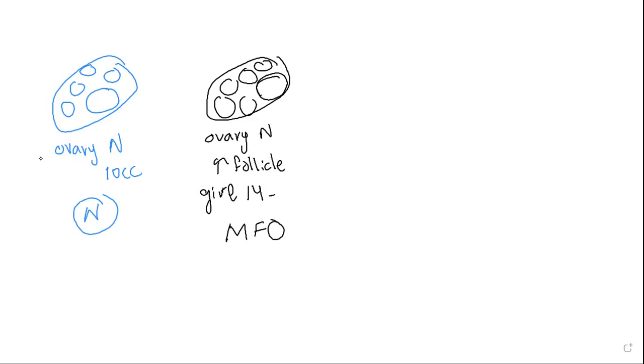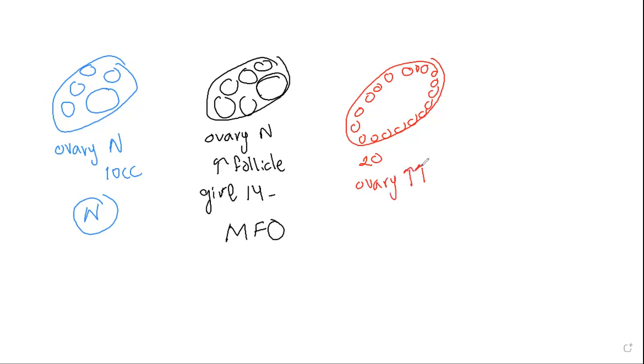Again, I have here an ovary that is large. And here I have many follicles, but they are rather small. This is essential. They're rather small, and they are arranged in the periphery. And they are multiple, around 20, and they are arranged in the periphery, and the ovary is enlarged. So this is what this is, PCO appearance.